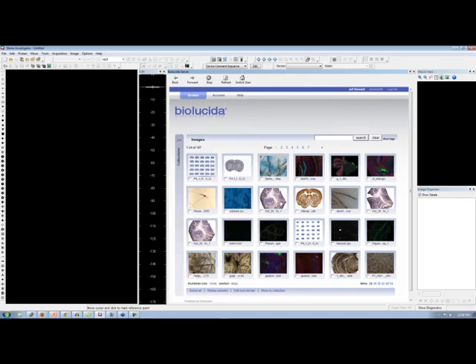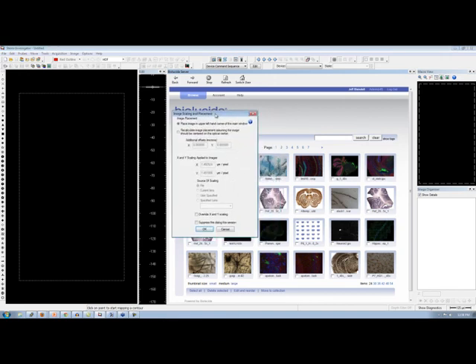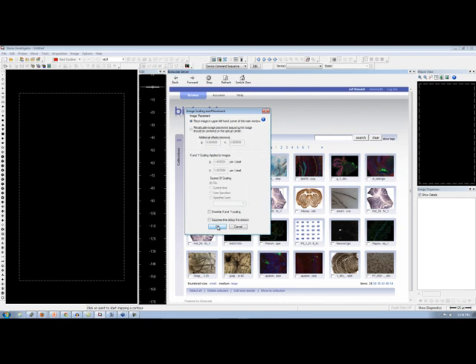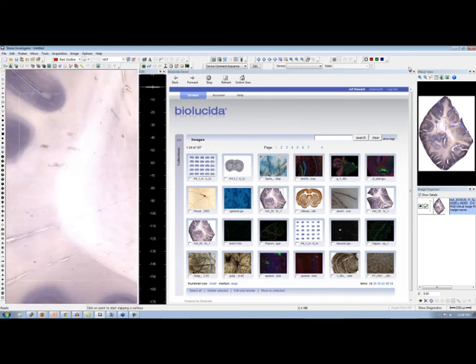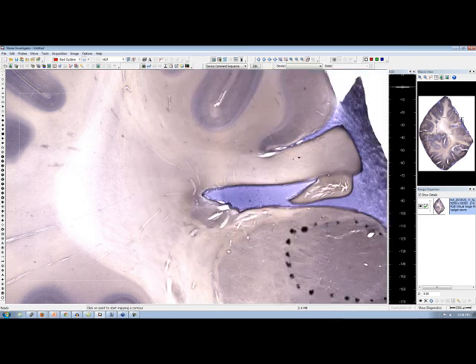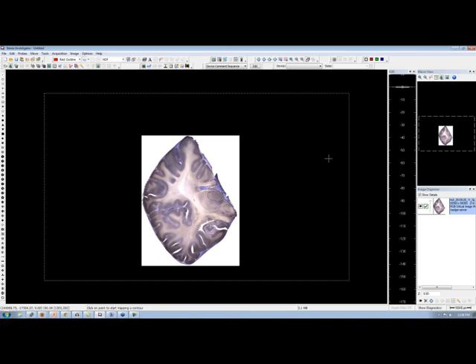Let's just click on an image here. When we click on this image, as you see, you get the same dialogues that come up in NLSI. Let's click OK. Move around in this image. Let me zoom out a little bit. This image is actually, let me close this. There, I can get a better view. This image is actually 50,000 by 66,000 pixels in X and Y dimensions. So it's a large image. Let's zoom out a little bit and get a better view of it.